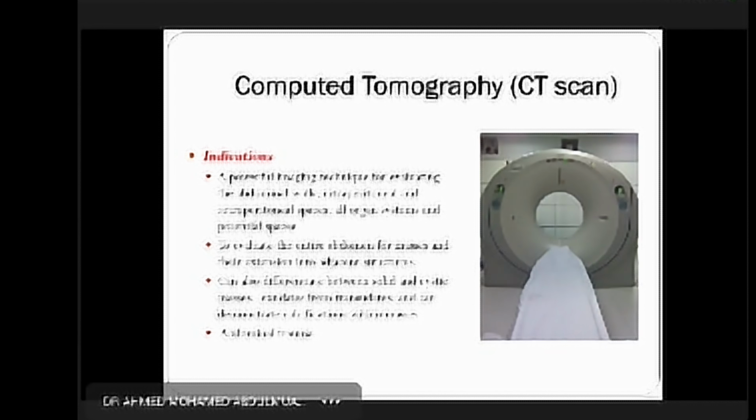Because we are giving 150 cc of contrast, which will be filtered by the kidney and excreted out by the kidney. So patient should not be having the risk groups or risk factors for contrast, which is like renal impairment, hepatic failure, cardiac failure, goiter, because this is iodine-based contrast, thyrotoxicosis, any thyroid diseases.